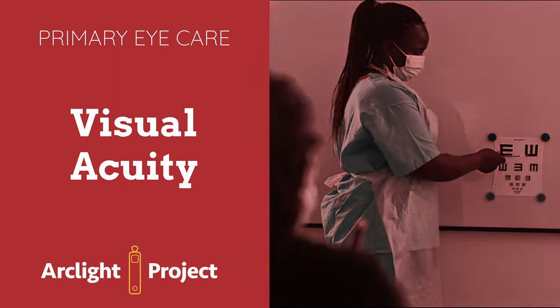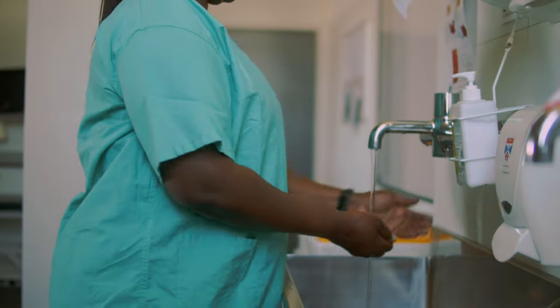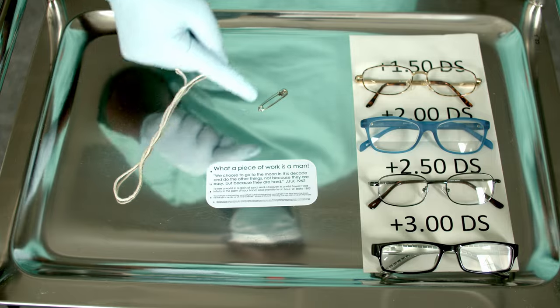This video demonstrates how to perform a distance and near visual acuity test. Wash your hands and don PPE. You will need the arc light charts and a safety pin to make pinholes.